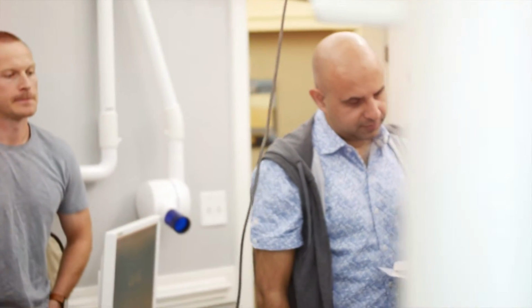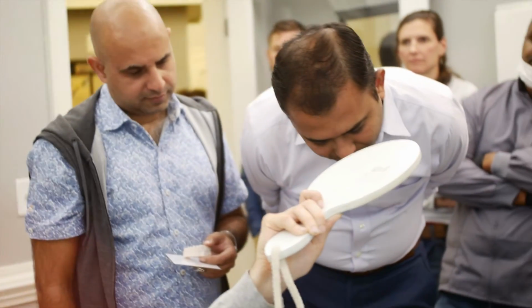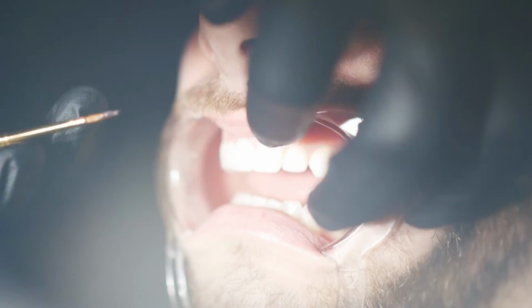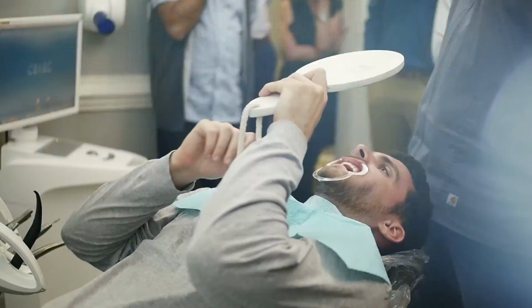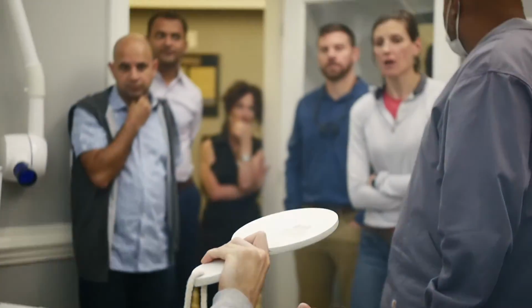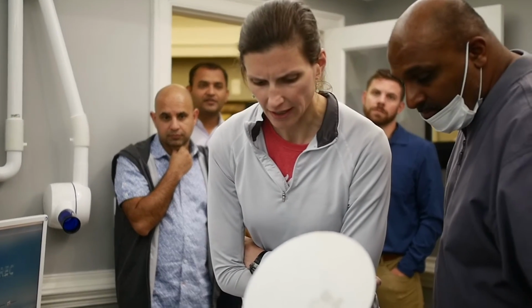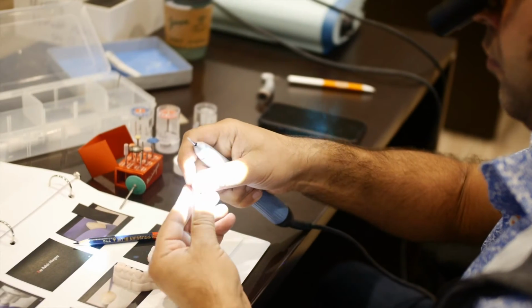And being so hands-on as an assistant in our office, it was really important for me to really grasp the concept of being able to better our crown qualities to deliver to patients. And I learned a lot of new tricks and tips as far as how to make the aesthetics a better quality to deliver to the patients. And also as far as the CEREC machine itself, tools that were very helpful in designing the final product.